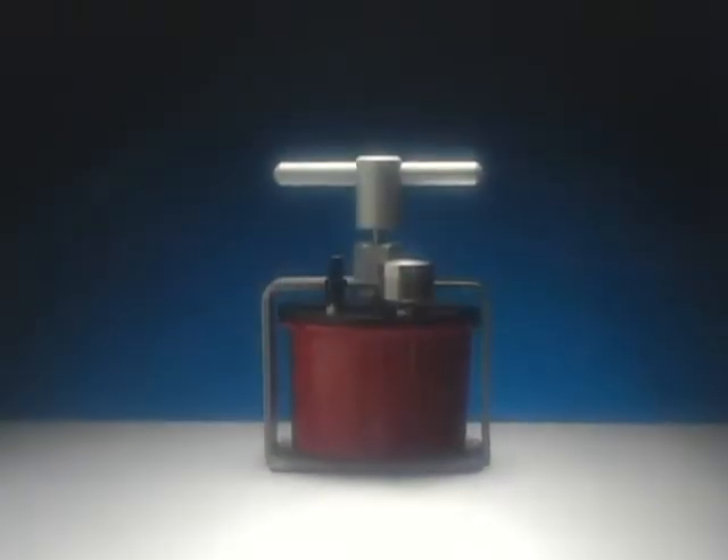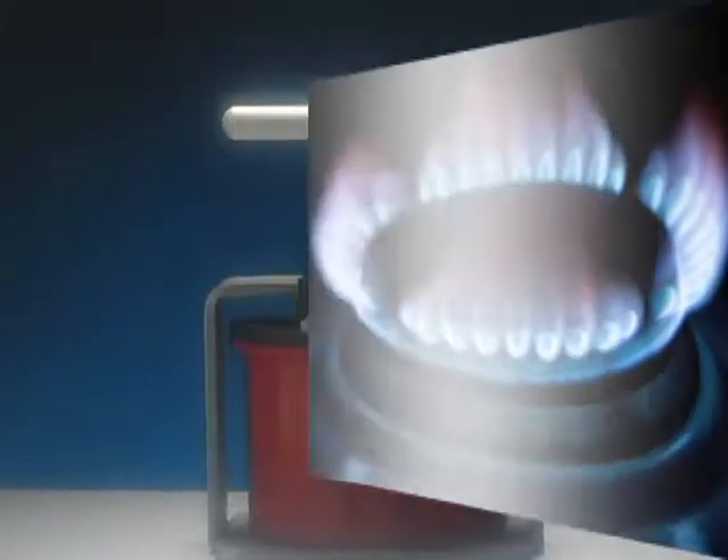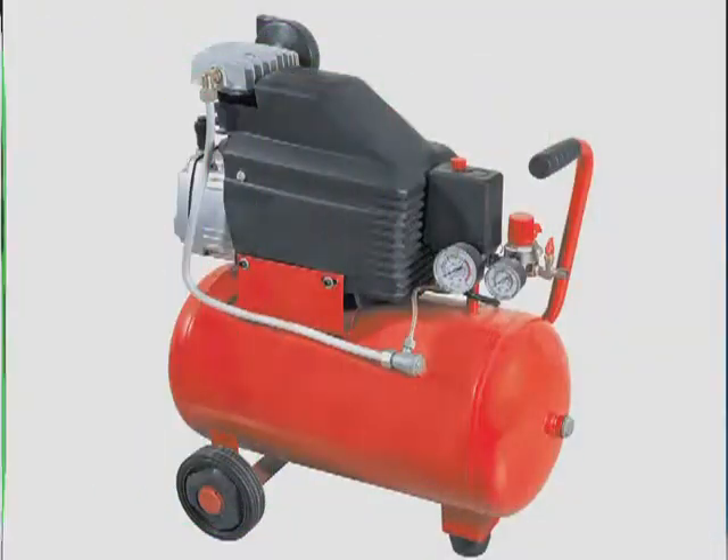The AquaPress is safe and fits conveniently in your practice lab, requiring no heat, electricity, or compressed air.